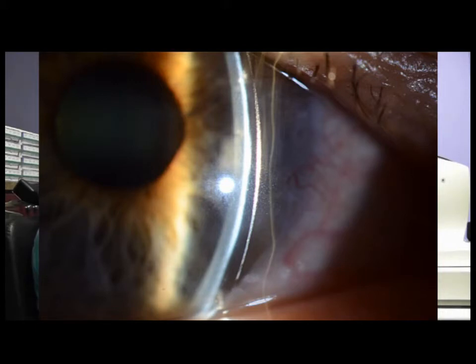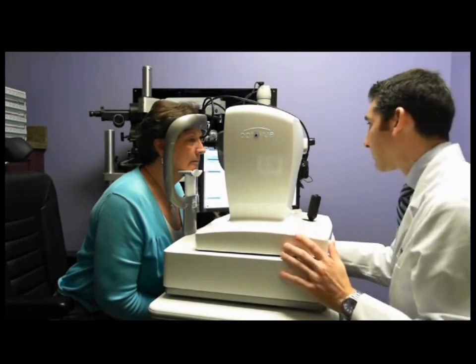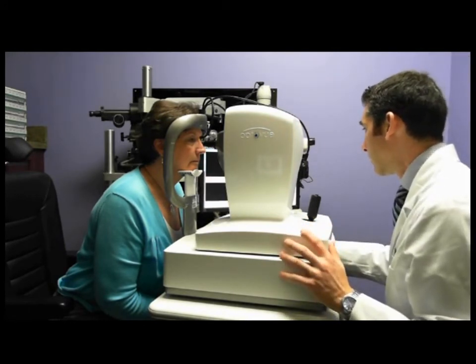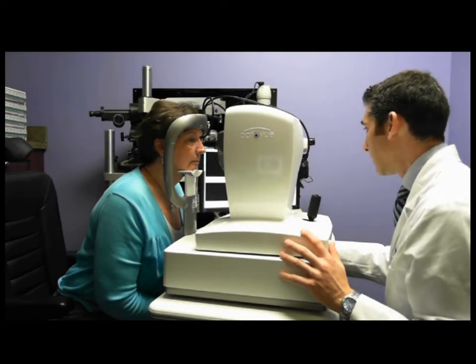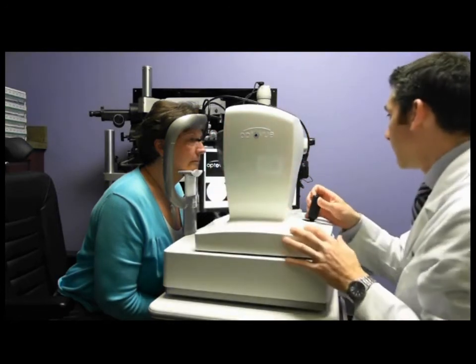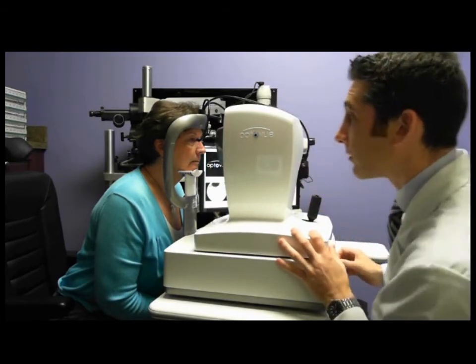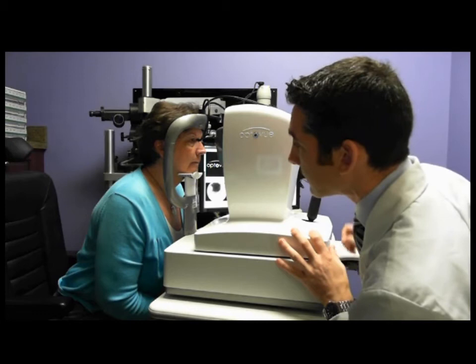So, in fact, next, since we have the luxury of the device, we're going to look with OCT. It's not necessary that you inspect scleral lenses with OCT, but it certainly is helpful. Now we're inspecting with OCT, and I'm going to do some line scans, and I'm going to make sure to have the infrared beam pointed here. There are many OCTs on the market that will accomplish what you want to do with scleral lenses.